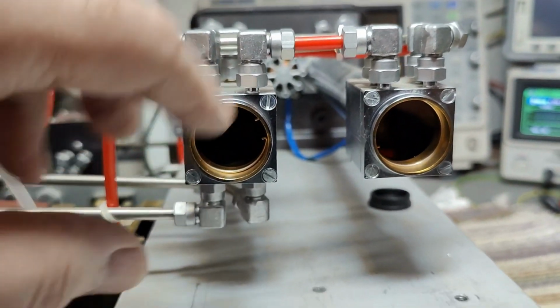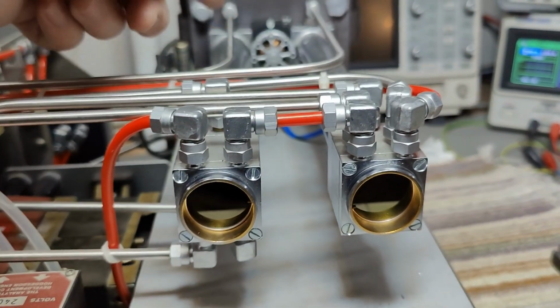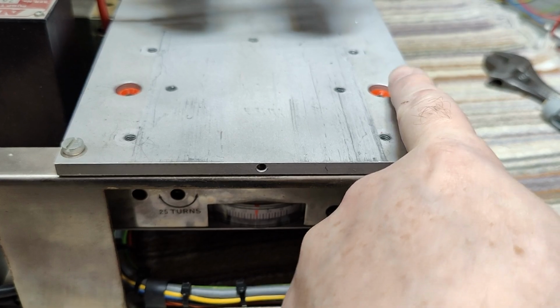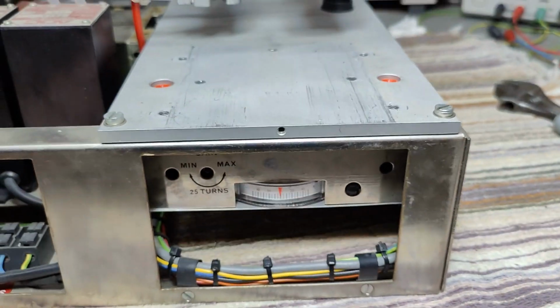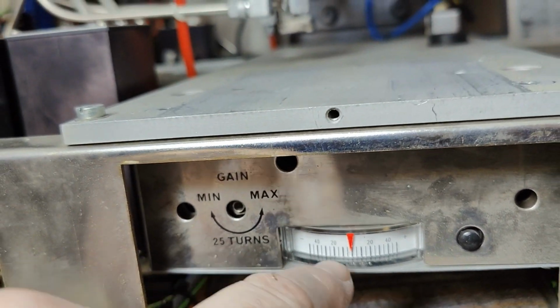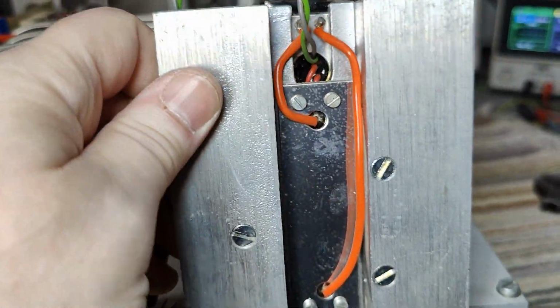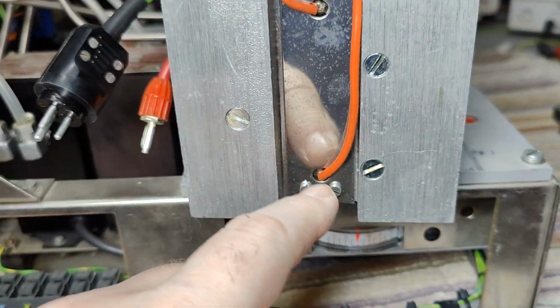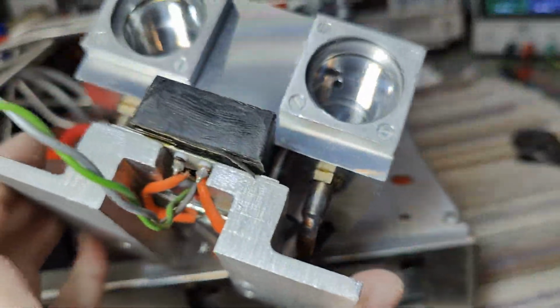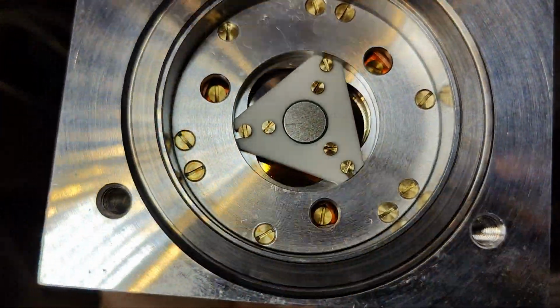There's probably a filter, so only the super infrared stuff that they want is going through here. And here is also some gases going via this, and it's of course completely closed down here. And we got the two signals here, and then down here is another fancy smancy amplifier unit that is doing some stuff. And under here we also got a little module with some wires that's connected to... Oh, this is just going to be interesting to figure out what is really inside this one. Can't wait to pull this apart.